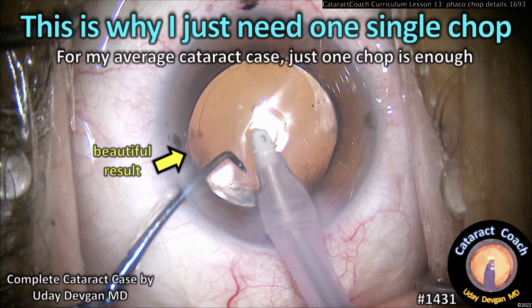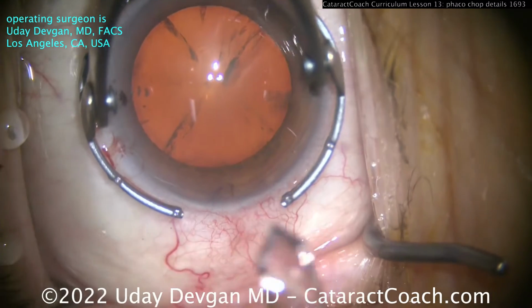This is why I just need one single chop. So for my average cataract case, just one chop is really enough. So let me show you the case.